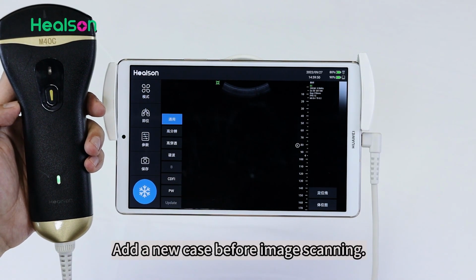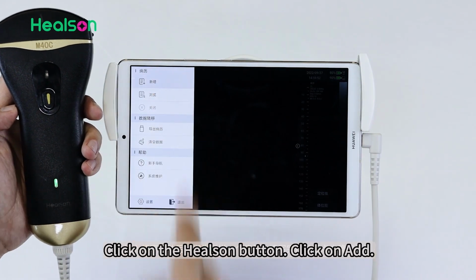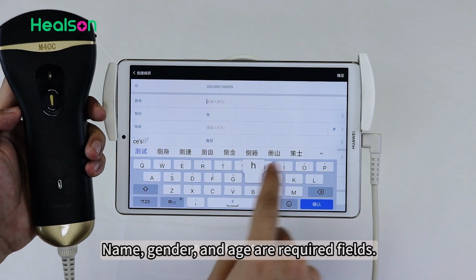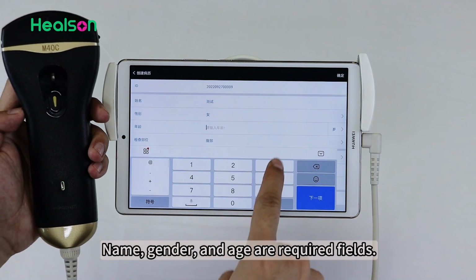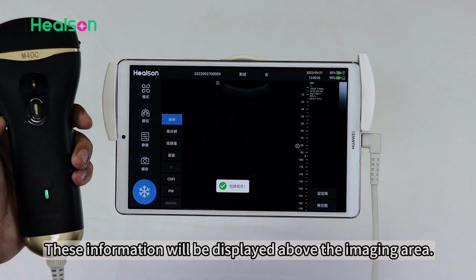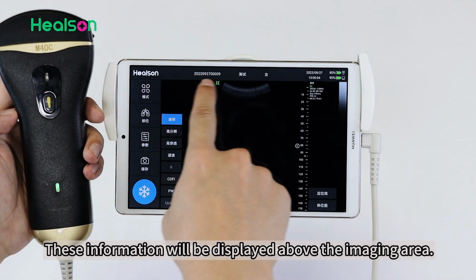Add a new case before image scanning. Click on the Healson button, click on Add. Name, gender, and age are required fields. This information will be displayed above the imaging area.